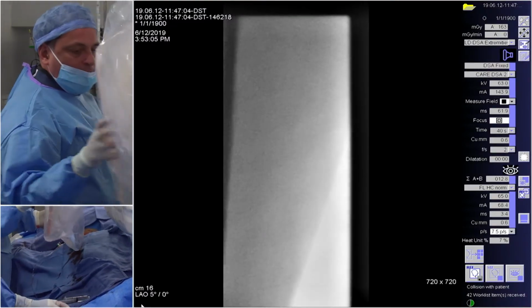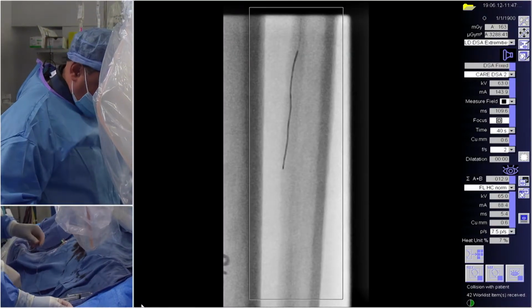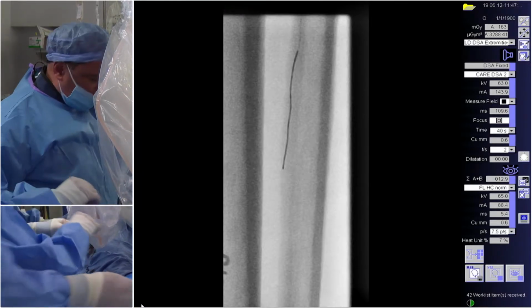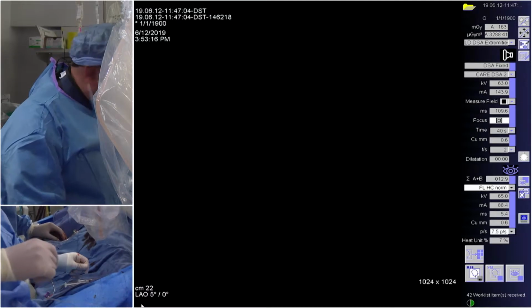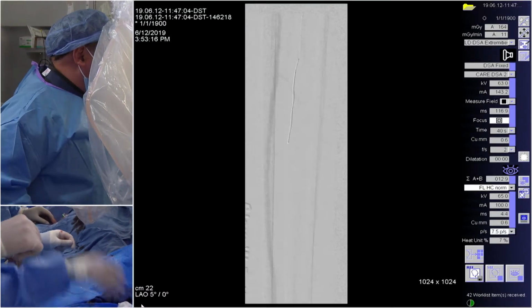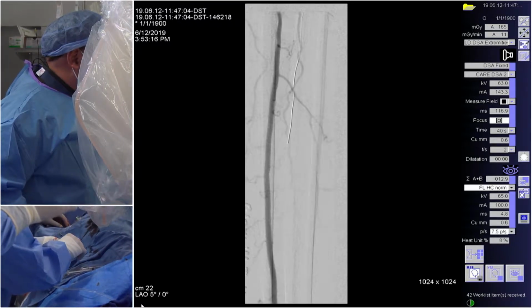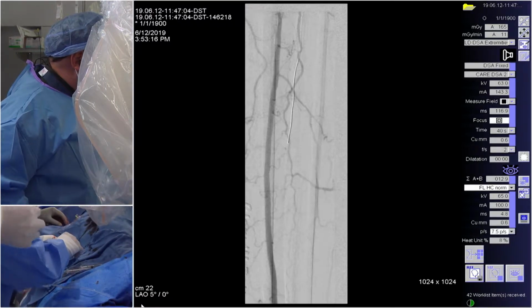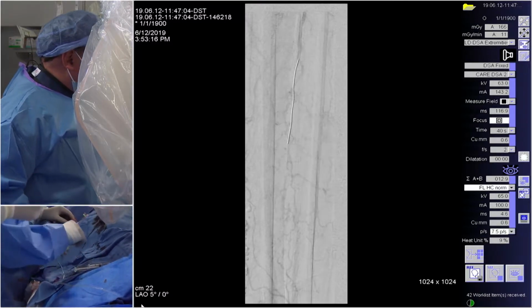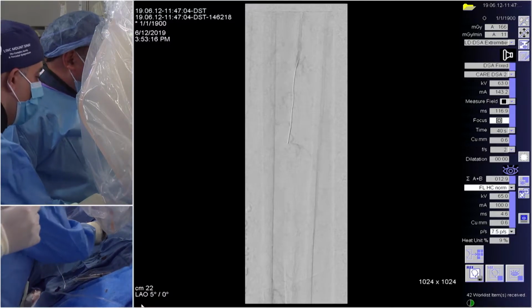Prakash, Jose here. Sometimes if these catheters don't work, you could use other crossing catheters like Turnpike or Corsair, particularly when 1.0 balloons don't work. Sometimes these support catheters help out. Yeah, so we have a support catheter here, Jose. You can see I'm kind of lined up right there. And so I really feel that now the flow is good to that point, and that's the ridge of calcium.